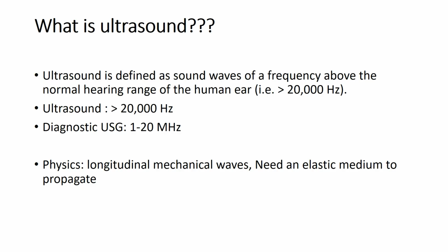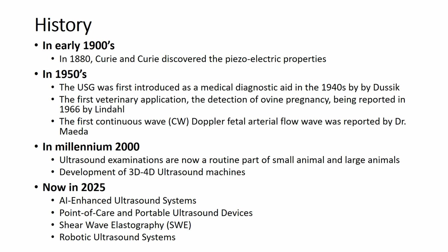The diagnostic ultrasound range is between 1 to 20 megahertz. The physics behind this ultrasound is the conversion of electrical energy into the sound wave and vice versa.